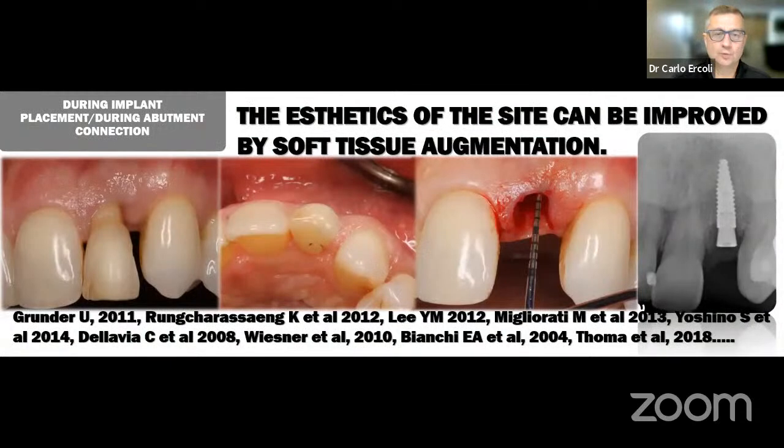So we need to be well versed in recognizing that and perhaps thinking if a soft tissue graft in this area can improve the outcome of those soft tissues. And the answer is often it can. So let's look at this case together. If you notice, that lateral tooth will be extracted, but you already have a problem in the aesthetics of that soft tissue, both from a buccal standpoint, and if you look at that tooth from a coronal, from an occlusal standpoint, you already see that there is a concavity of that soft tissue.